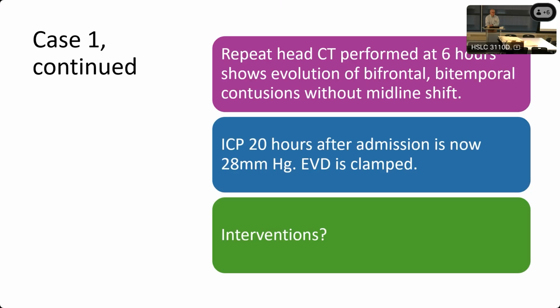Tragus, external auditory meatus, that's zero. What should be at zero on an EVD? The zero. So you go to the bedside and you have this adjustment thing and it goes to zero, so that's zero.